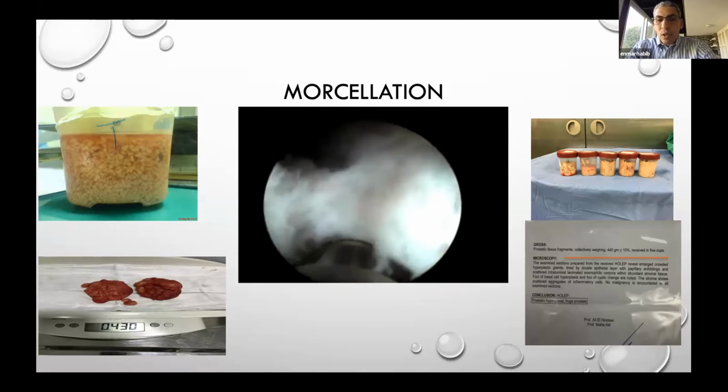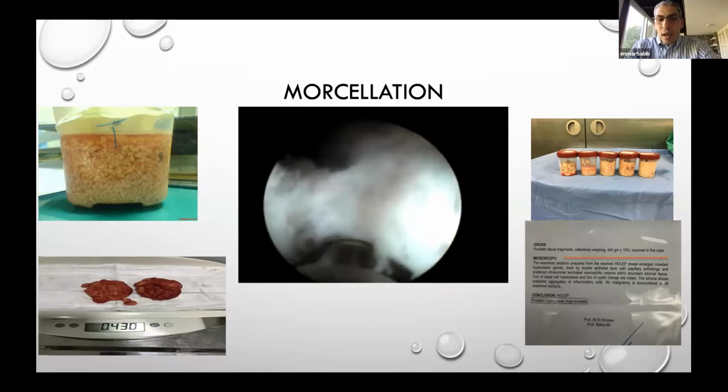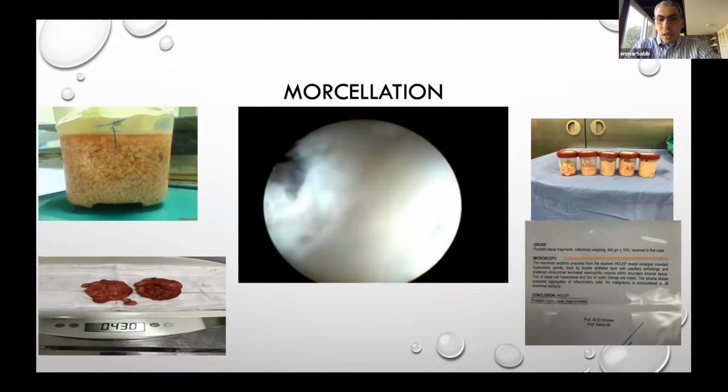But you have to keep the bladder over-distended. So at this step, I use 2 Y connectors to overfill the bladder. You have to have good hemostasis before starting morcellation to have a good vision. After that, you put in the blades of the morcellator and press the foot switch of the morcellator pedal to activate suction, and you get the adenoma attached to the tip of the morcellator.